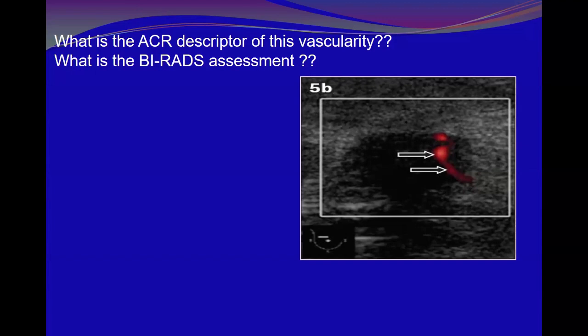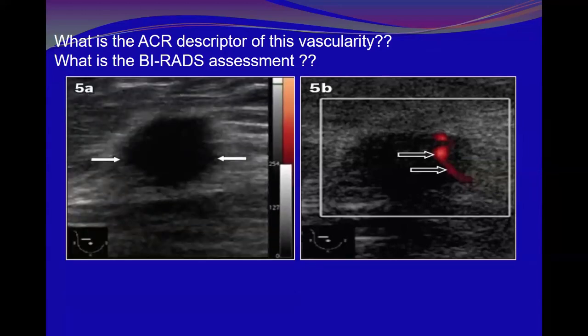It is intra, without seeing a marginal capsular vessel. It is only intralesional. It is irregular. You see, it is not homogeneous or of uniform caliber. The caliber is irregular. This portion is different from this, and different from here. And when you look at this, can you see here the spiculations and the echogenic rim?